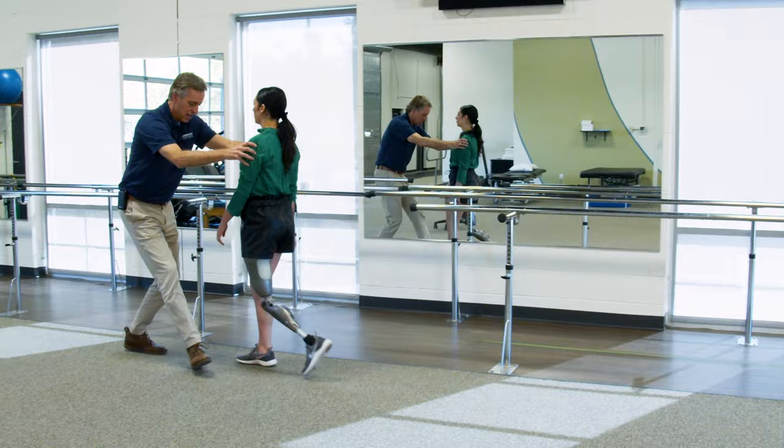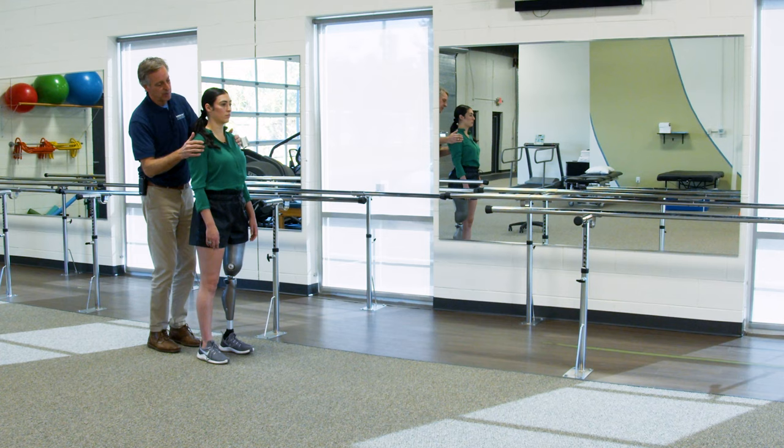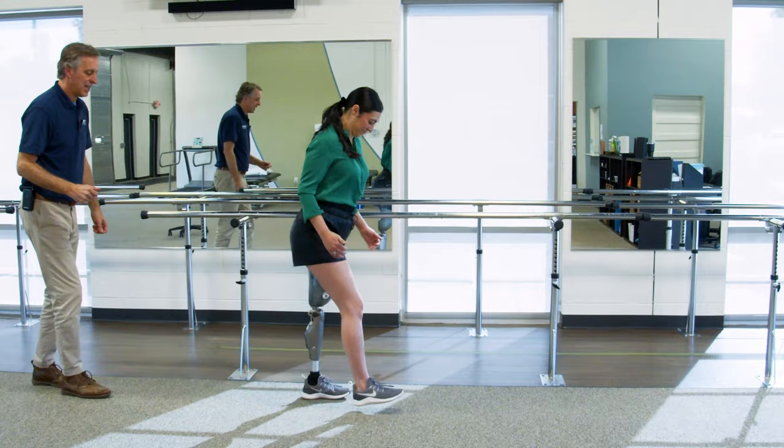Now, if I'm here and I say, okay, Tracy, we've got it. We're working out pretty well. All I want you to do is, we're going to mix it up a little bit. I'm going to have you step and I'm going to give you a command as to what we want to do different. So all I want you to do is just take a normal step forward. And now go ahead and step and chop step. Boom. Boom. Get that knee bending. There you go.